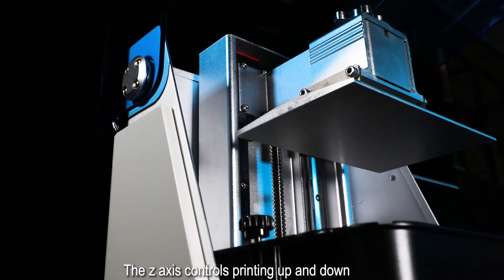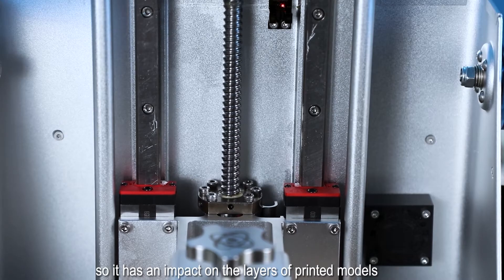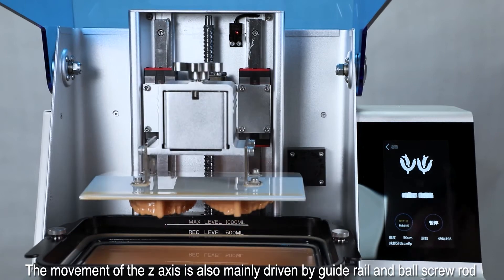The Z-axis controls the printing direction — up and down — and has an important influence on the layers of printed models. The movement of the Z-axis is mainly driven by guide rails and ball screws.